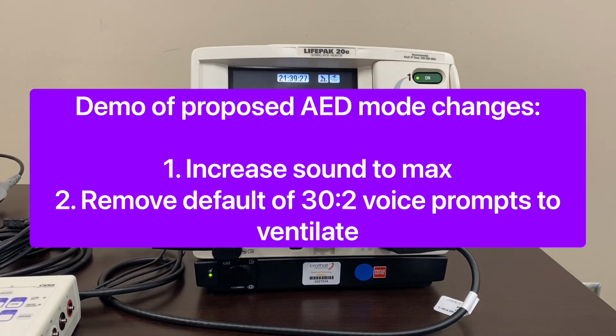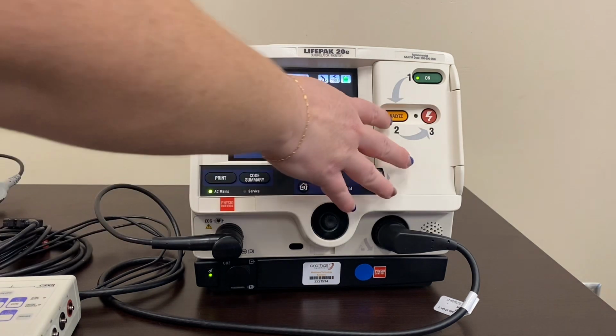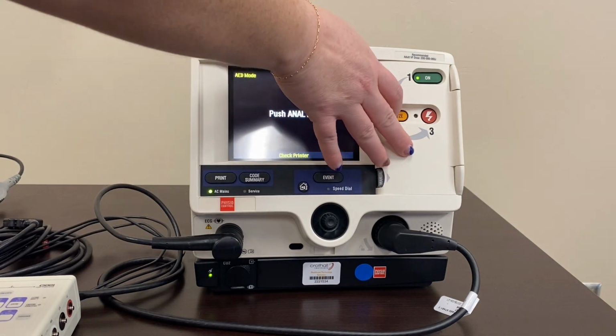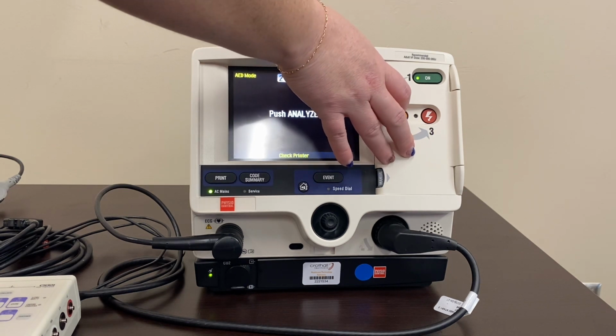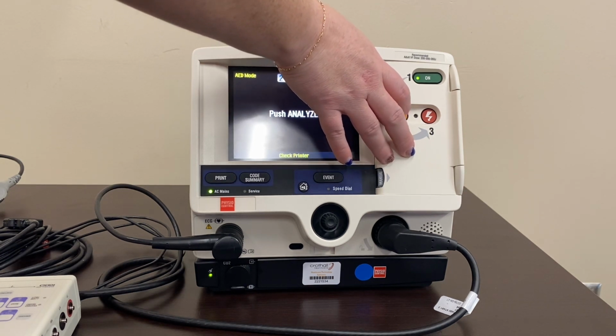So now we are looking at the LIFEPAK that is assigned to the education department. You'll notice it's much louder, and then it also does not have the voice prompts for providing ventilation.